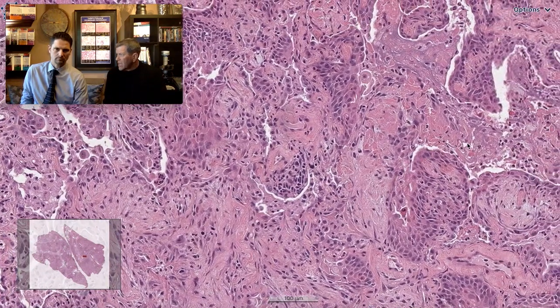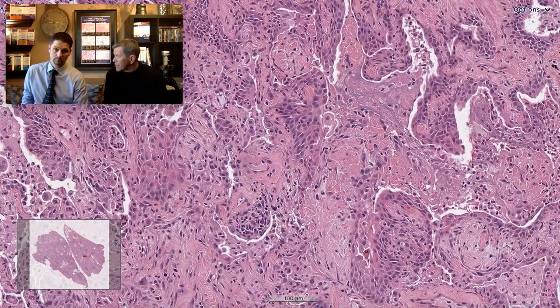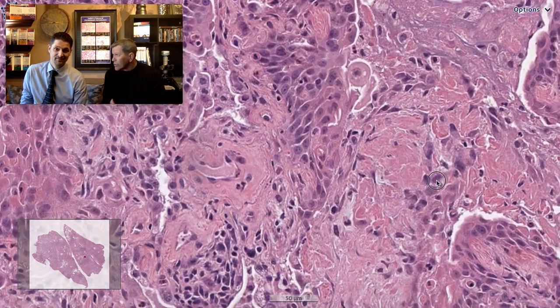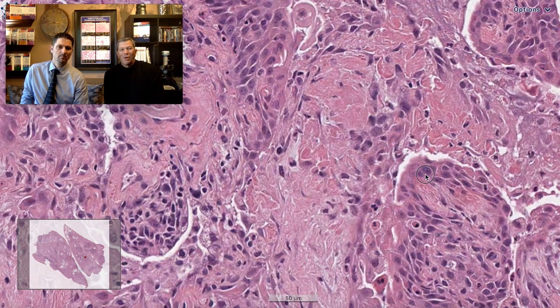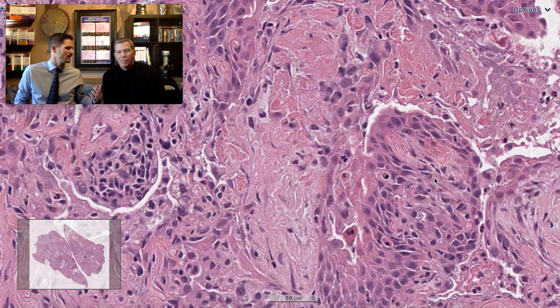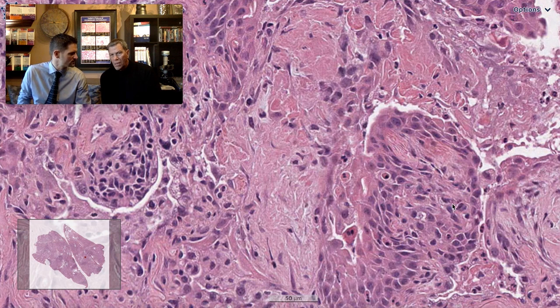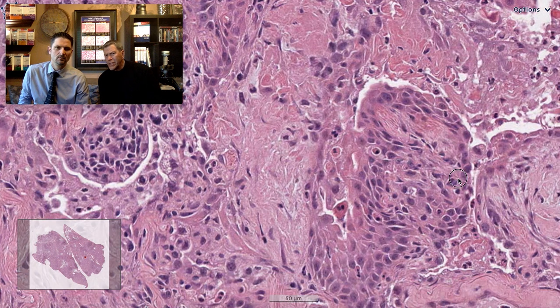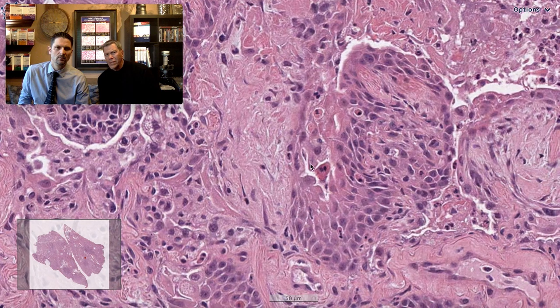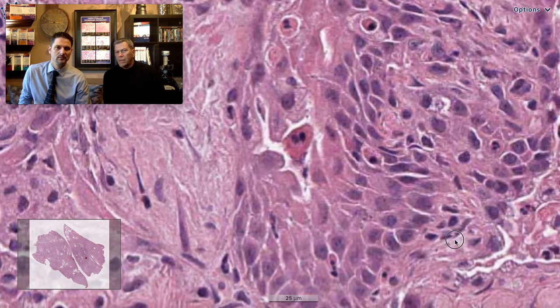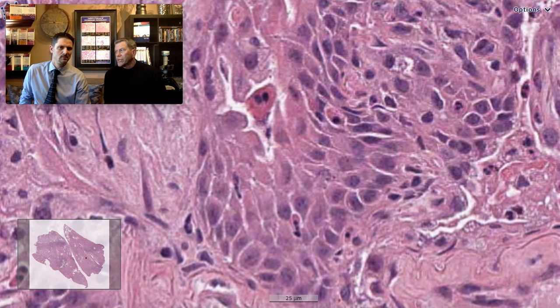Maybe this is microscopic honeycombing — maybe this is acute exacerbation of idiopathic pulmonary fibrosis, which the patient was never known to have, never diagnosed perhaps. But if we go to higher power in these areas, you'd expect peribronchial squamous metaplasia. But instead we have squamous epithelium. Is that a dyskeratotic cell right there in the center, the pinky cell? This is becoming curiouser and curiouser.